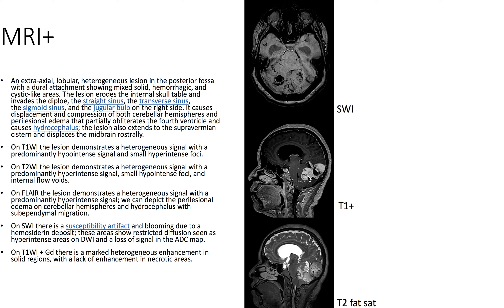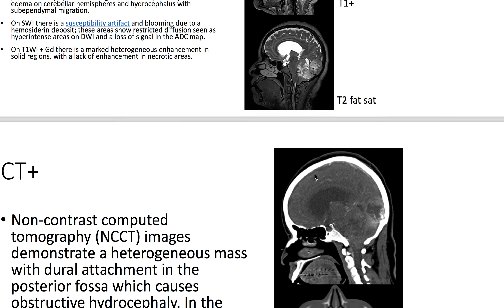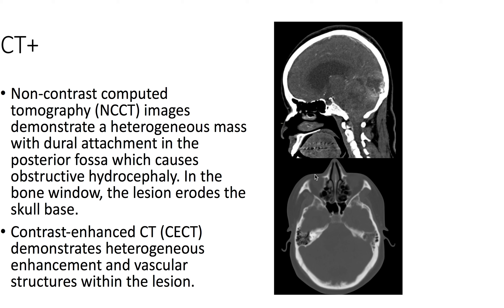On MRI, we see an extra-axial lobular heterogeneous lesion within the posterior fossa. It has a dural attachment and has mixed solid, hemorrhagic, and cystic-like areas. On T1-weighted imaging with contrast, we see marked heterogeneous enhancement in the solid regions and a lack of enhancement in the necrotic areas.